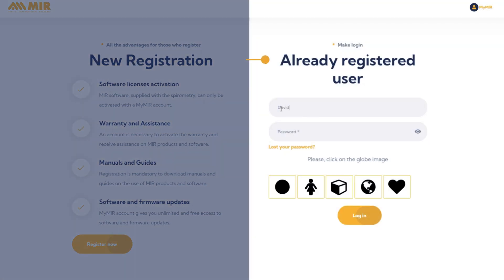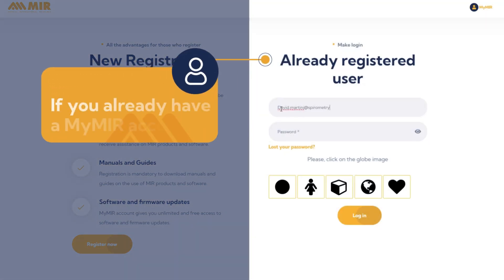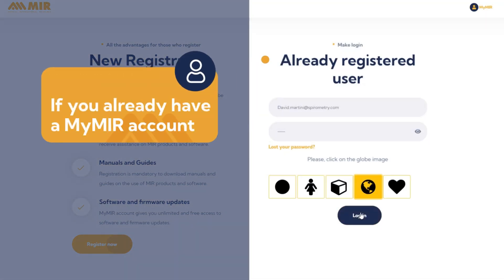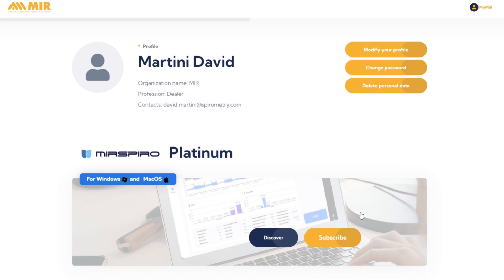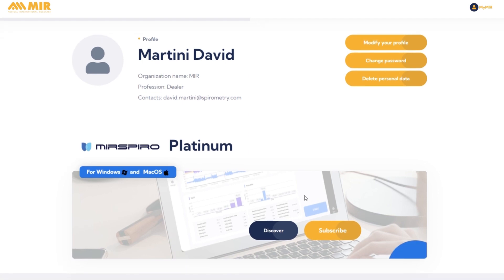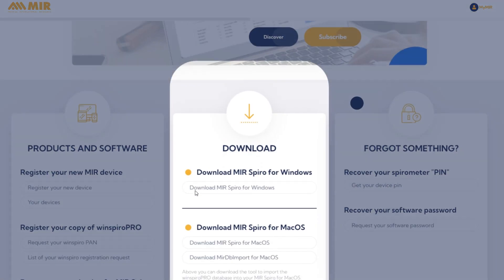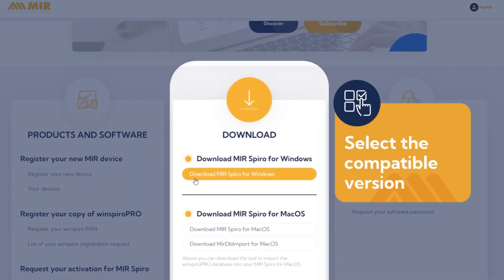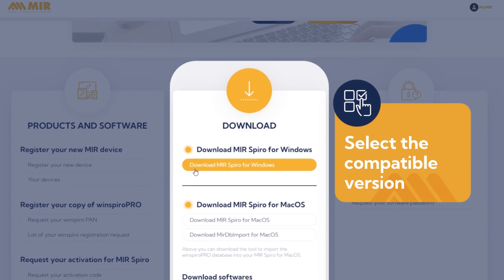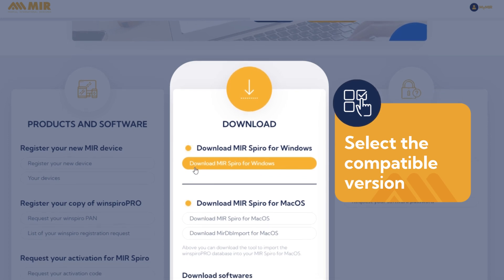If you already have a MyMIR account, log in. After having logged in to the MyMIR area, download MIR Spiro by selecting the compatible version with your operating system.